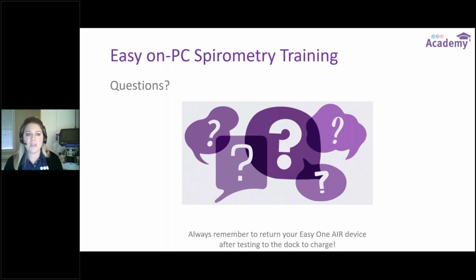But essentially, when we block the mouthpiece, it's not really a calibration. Essentially, it's just taking in all the environmental factors and preparing the sensor for the test. So it is a checkpoint, but not technically a calibration. Hopefully that was clear as mud.